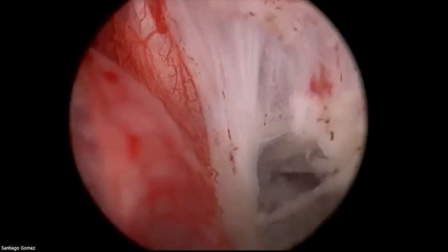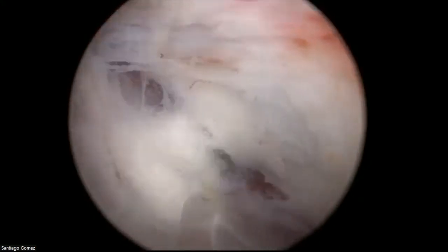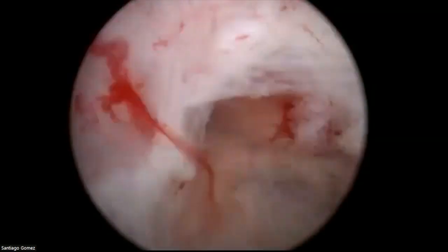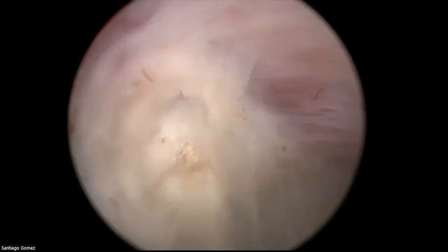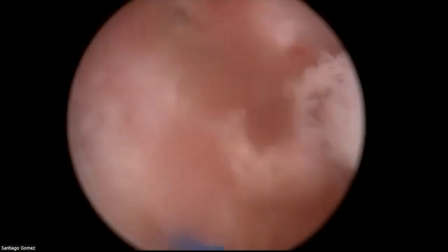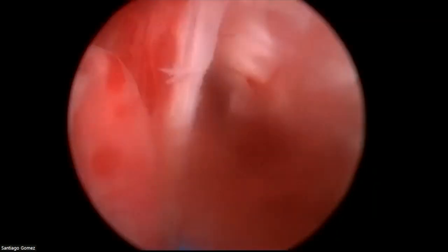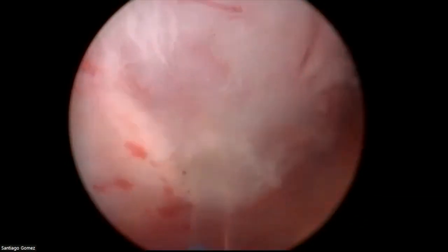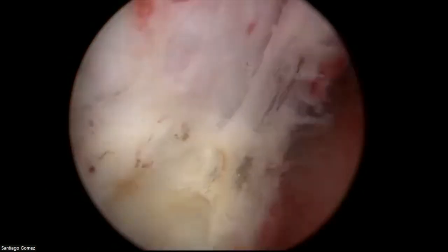Enter the plane. I have lost respect for this step of the operation. You know, I don't hesitate too much. I just go to the floor and I move laterally and I try to understand how steep this plane is. You see, in the bigger prostates it tends to be more vertical, in the smaller prostates it tends to be more horizontal.